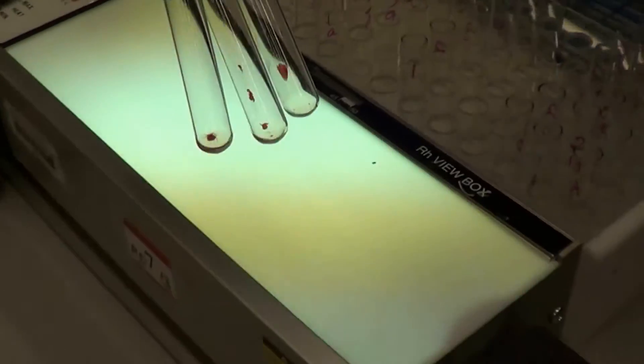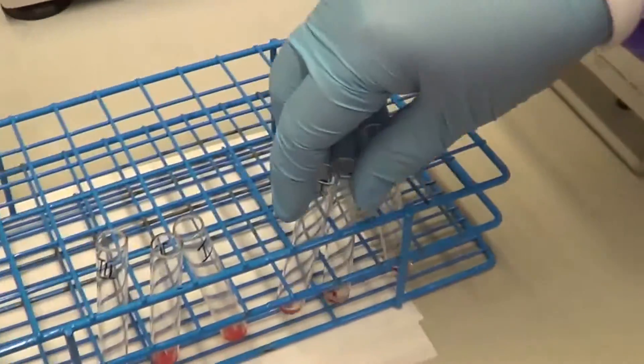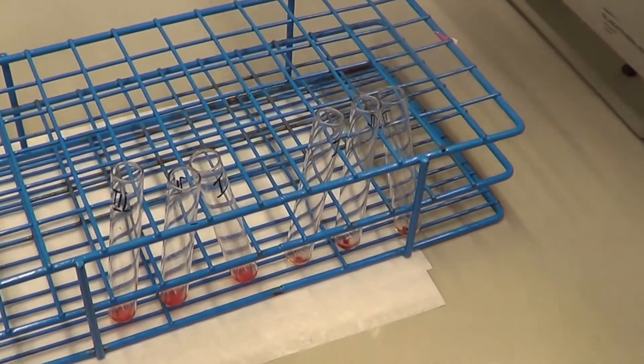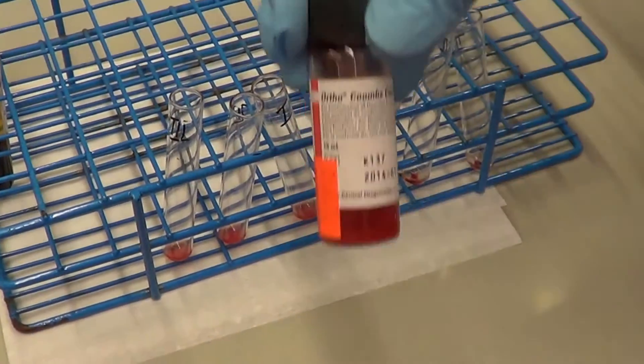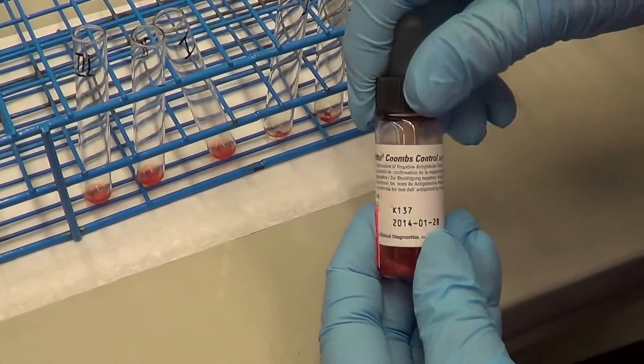With the negative anti-human globulin test, we have to add one drop of our Coombs control cells or check cells. These are O positive cells that are coated with IgG.